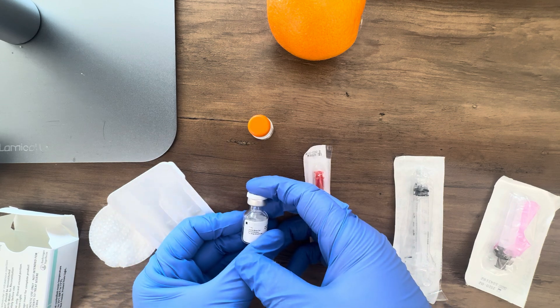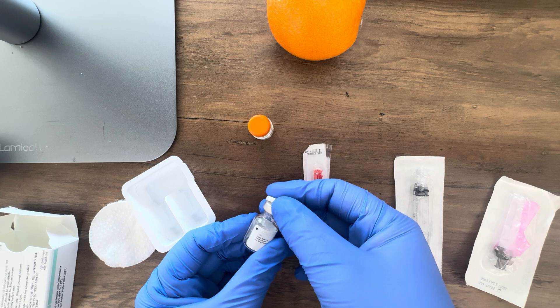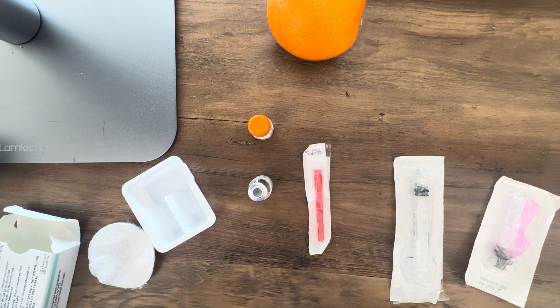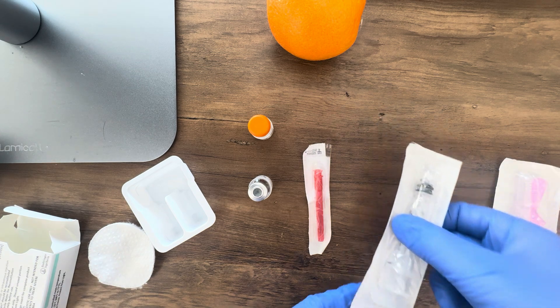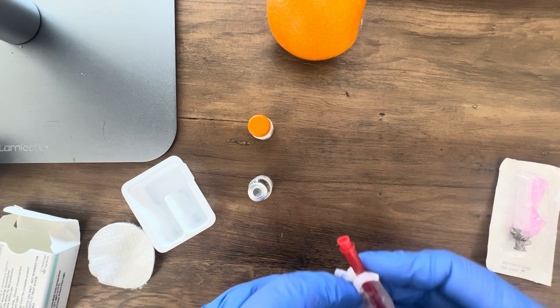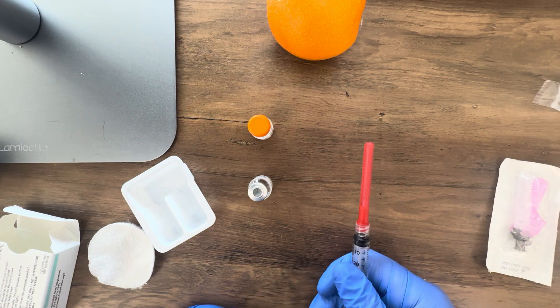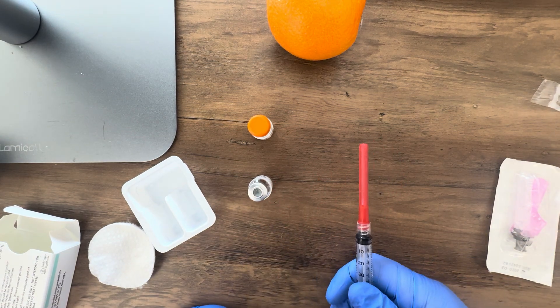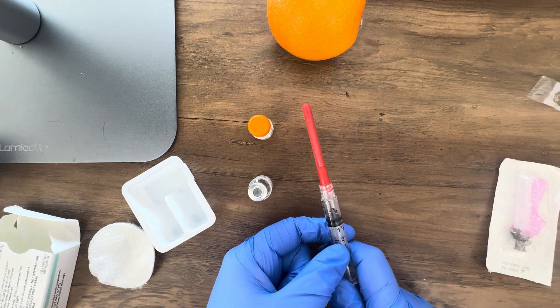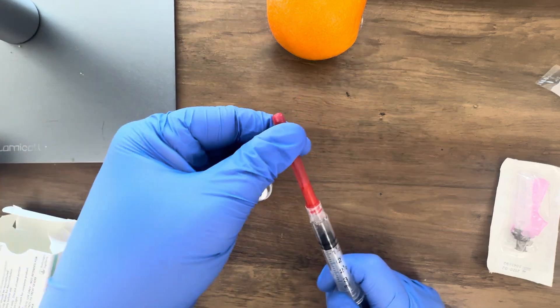Usually this comes with a cap on it that keeps the top surface of the vial sterile, and you would just pop that right off when you're ready to reconstitute your medication. I'm going to take my three ml syringe and apply my blunt fill needle to the end of it so I can draw up the sterile water out of the vial. There's one ml of sterile water in this vial, so I'm going to draw up one ml of air so I can replace the volume in that vial and make it a little easier to draw up.